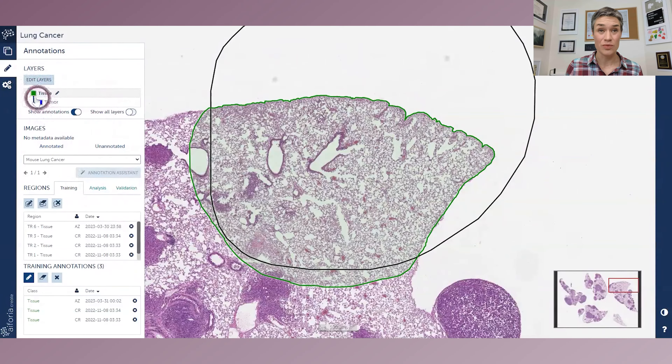Next, we want to detect the tumor in the tissue. And here's the clue — in the tissue. That's why in our layer tree, tumor is a child layer; it's lower, because we are detecting the tumor within the tissue. There is no point in looking for it outside of the tissue. We already identified where the tissue is in the first layer, and now we will only look within the tissue. Again, we ask a binary question: is it tumor or is it non-tumor?